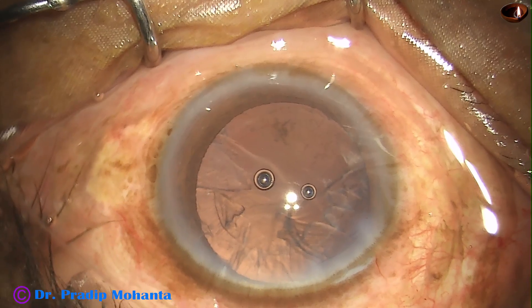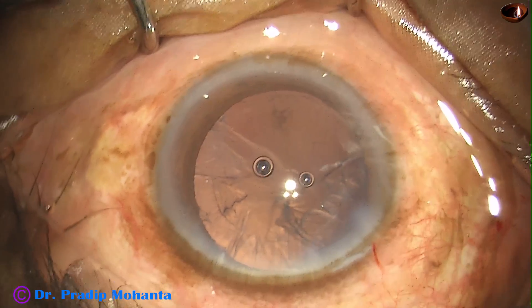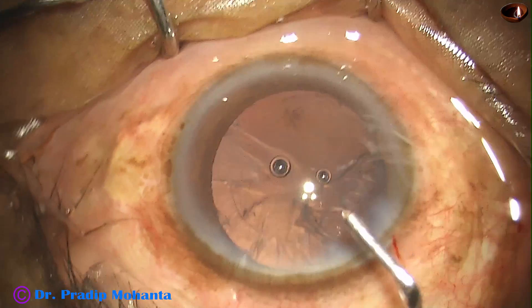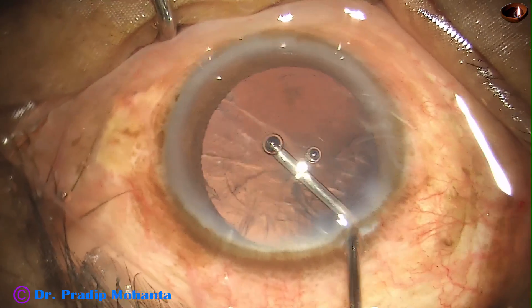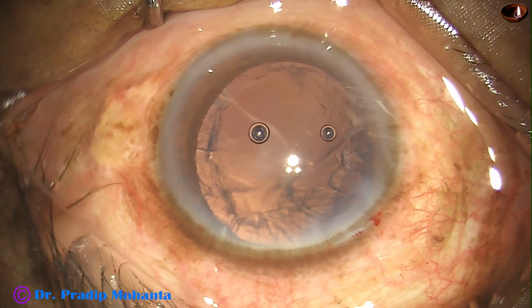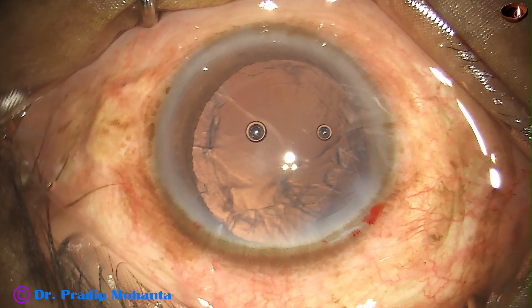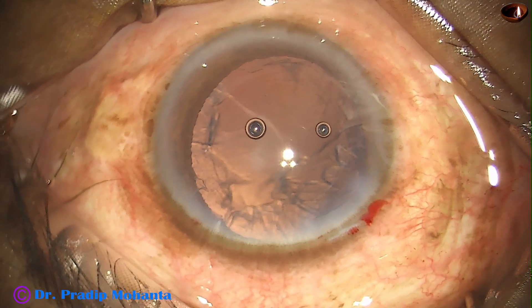Now inject some viscoelastic to protect the corneal endothelium. And now in this case, I am going to use bimanual irrigation aspiration for cortical cleanup.